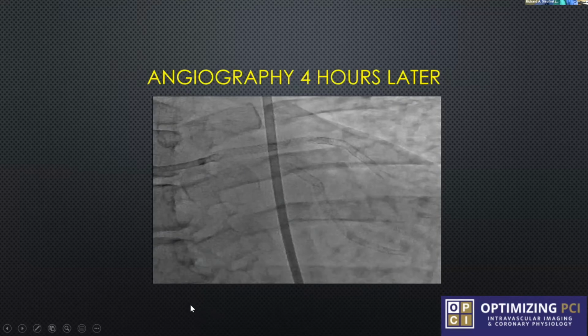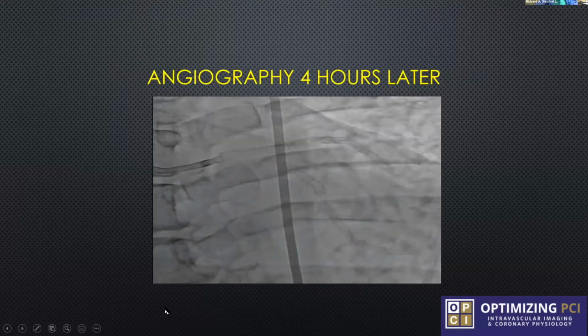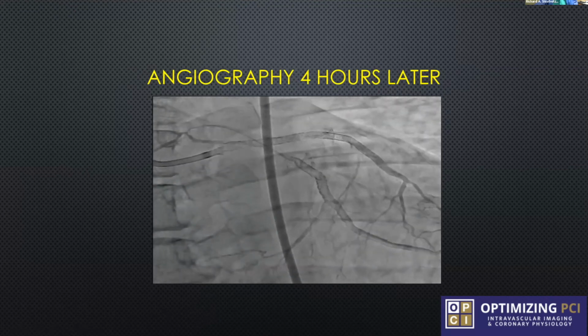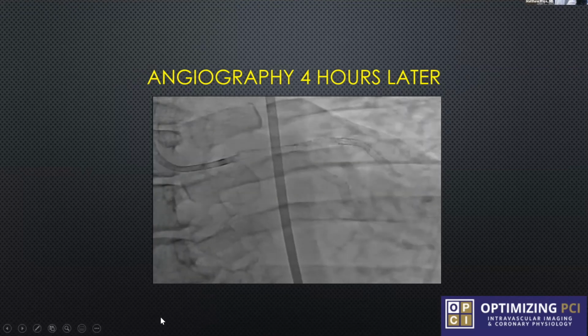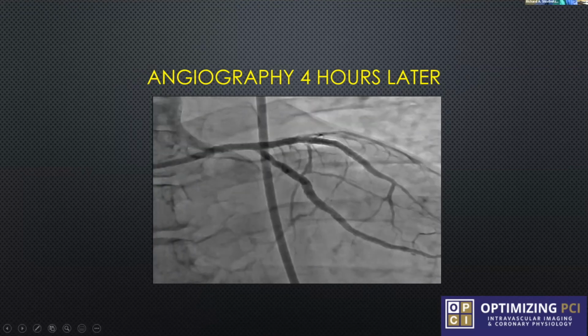And 4 hours later, I do this angiogram, and look at the ostium of the left main. Do you see the stent? Yeah. Right. So I have a problem with the stent. The vessel's open, but I have a problem.